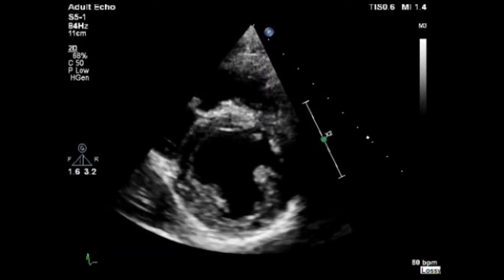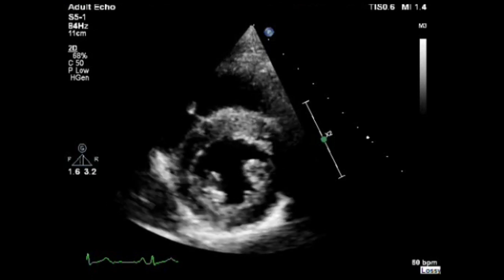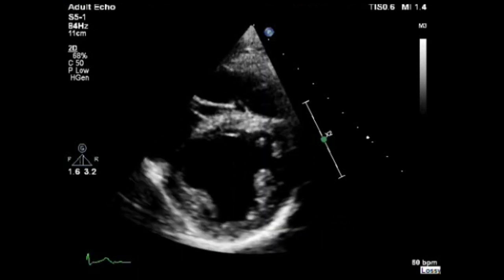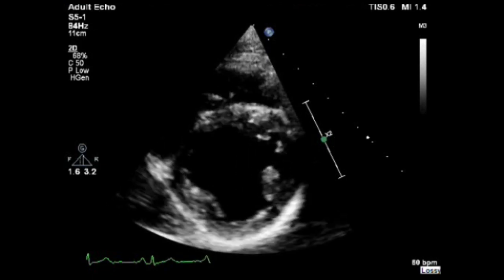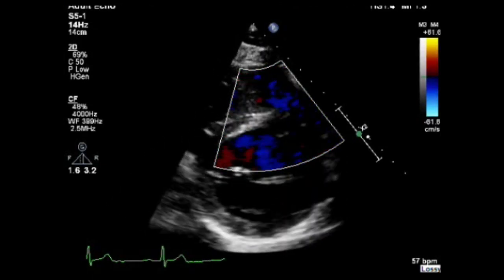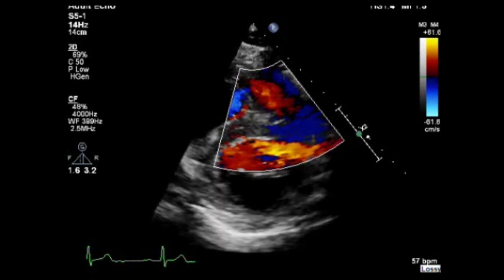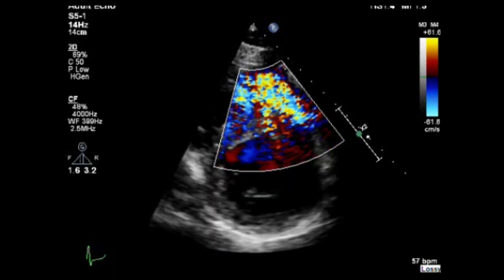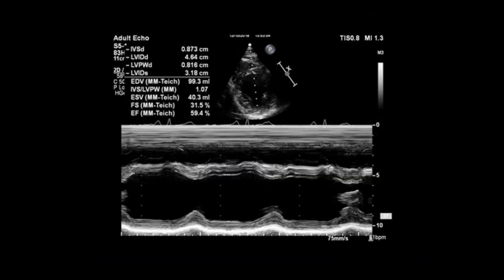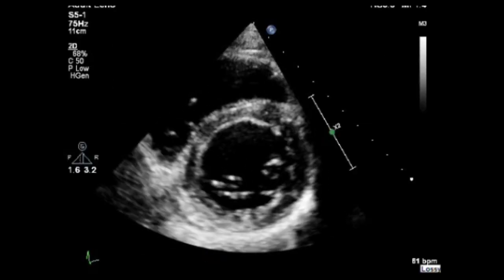Now do the same and assess for any motion abnormalities of the middle segments of the left ventricle. At this level you can use color Doppler to assess the integrity of the left ventricular septum and to look for any ventricular septal defects. Use M-mode across this view and measure the diastolic and systolic diameter of the left ventricle, septum, and posterior wall, and obtain an estimated ejection fraction by the Teichholz method.